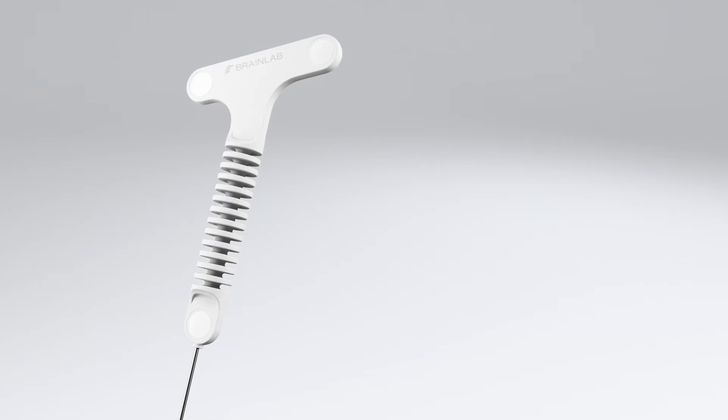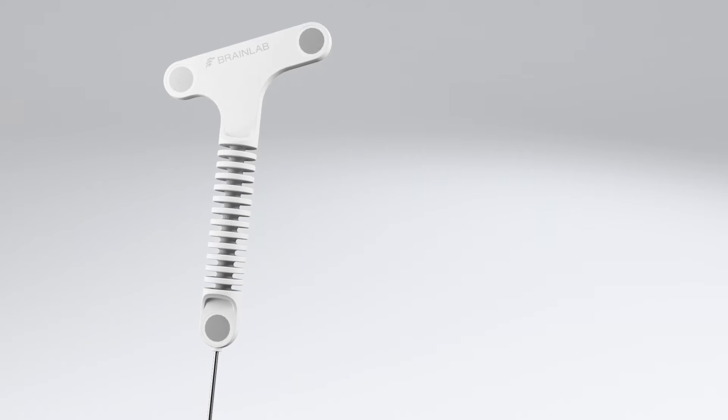The BrainLab disposable stylet is designed for quick and easy navigation during the freehand placement of shunts or ventricular catheters in neurosurgery.